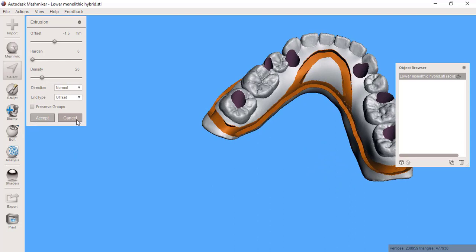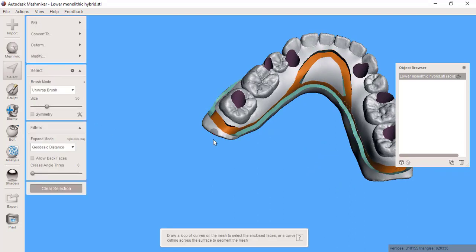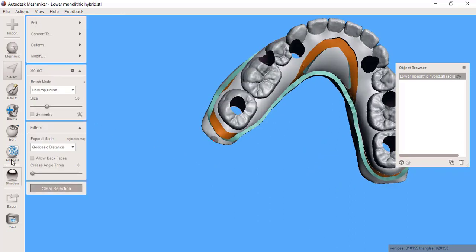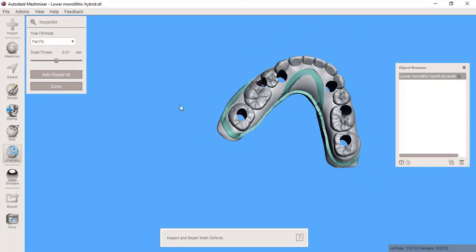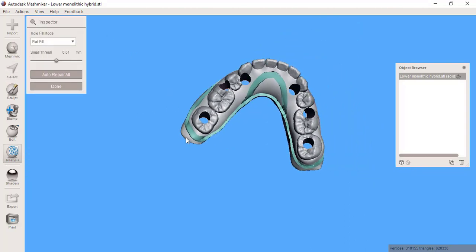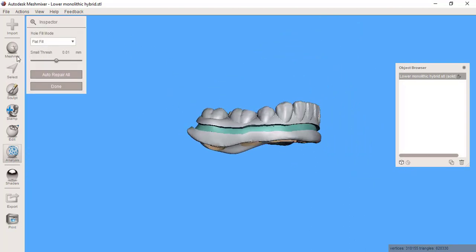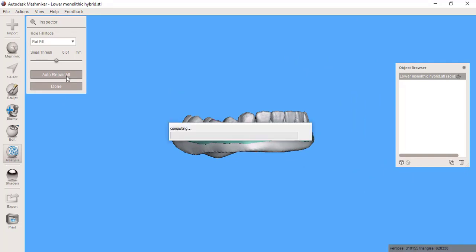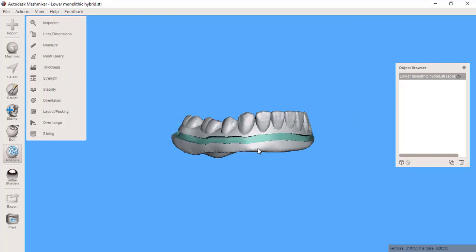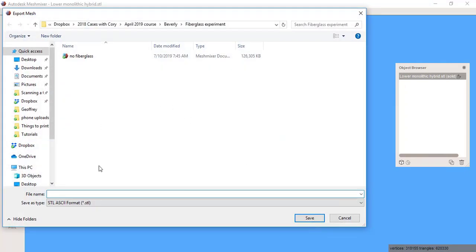Let's accept it and then run your analysis inspector. Try to find if there's any kind of imperfections in your mesh. That looks good. Click done and now I'm just going to export this for printing.